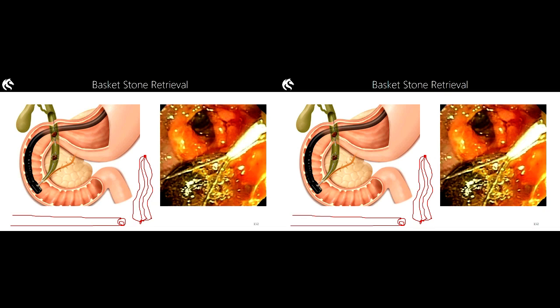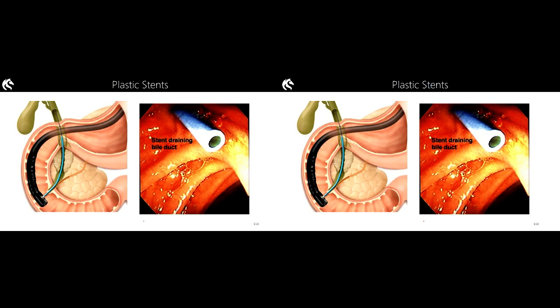And while a sphincterotomy is not a method of removing the stone, it will facilitate easier removal by having a larger hole. Does that all make sense? All right? Cut the hole to make it big, to make things easier. Use a balloon for anything and use a basket or cage for the big rocks. All right, now we're on the home stretch.